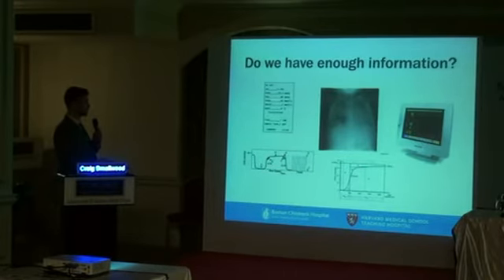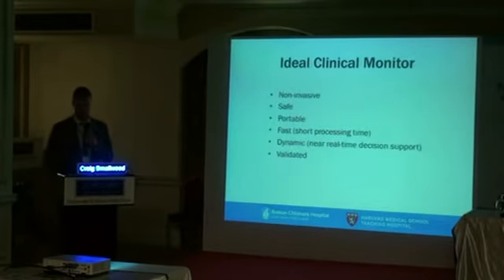We have chest films and MRI or CT images. We have the physiologic parameters as well as some capnography. And capnography, I think, is an area that is really desirable. I'm going to talk about that tomorrow. But these are the things that we have to go on, as well as whatever the mechanical ventilator is showing us on the screen. So the ideal clinical monitor, in my mind, has these principles.